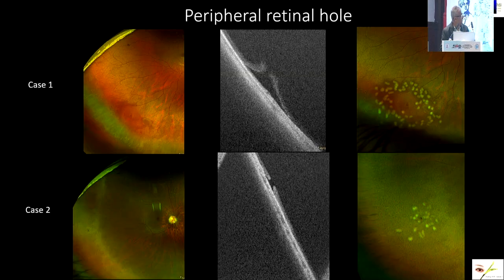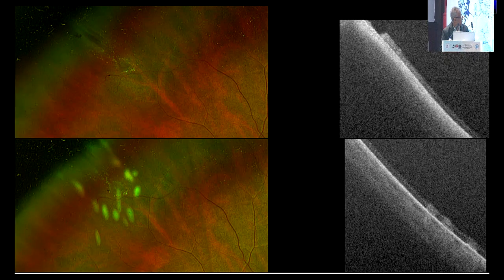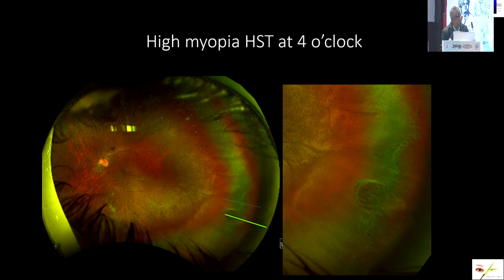Now, this is again a retinal hole with subclinical detachment above, and the retinal hole is lasered there. Again, these are the laser marks you see on the OCT. This is the edema which is created after the laser, so this is how laser would appear on OCT. Now I think this machine is worth the $1 million.